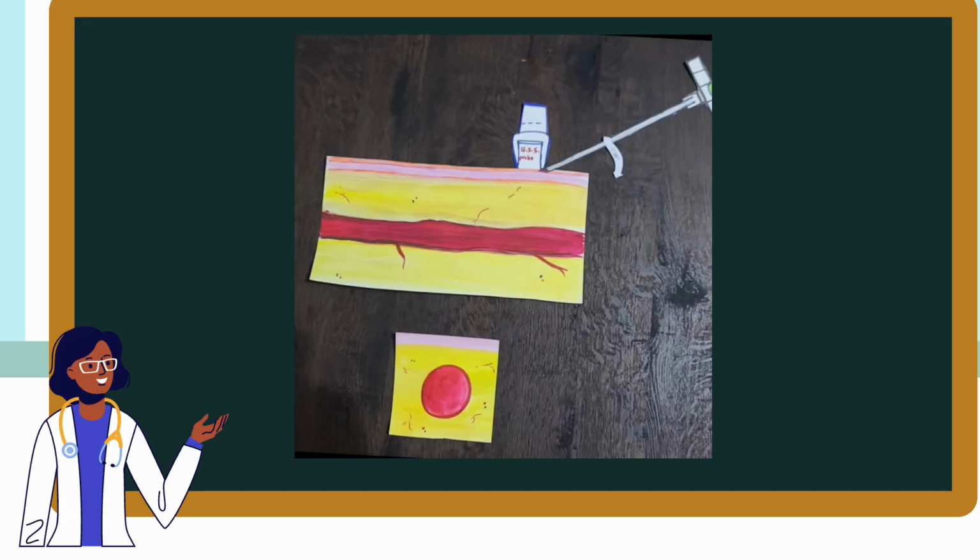This video demonstrates two images. At the top, we have the longitudinal image of the tissue for better understanding of the procedure. At the bottom, we have a short axis out of plane view that will be seen on the ultrasound screen as the procedure is being done.